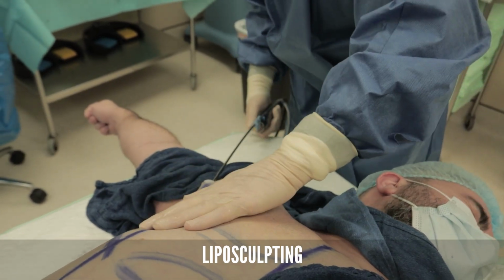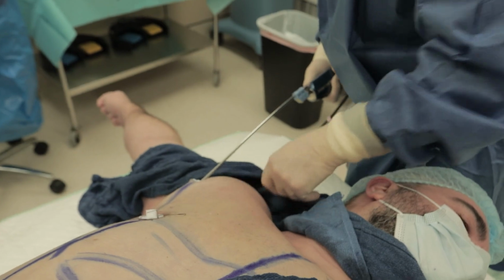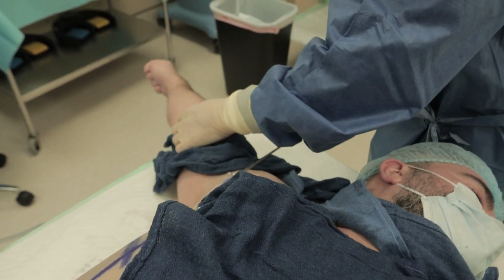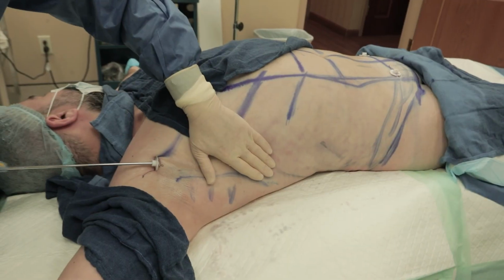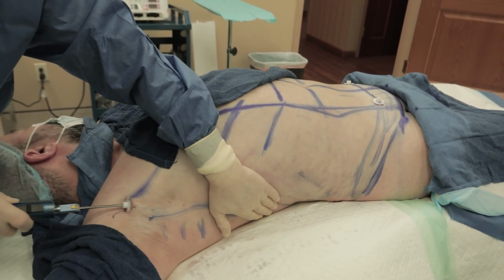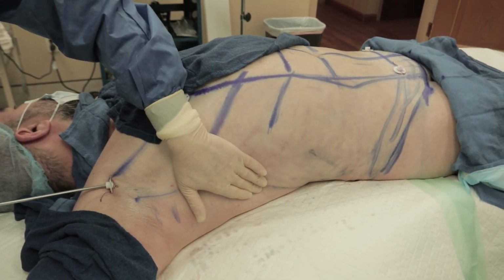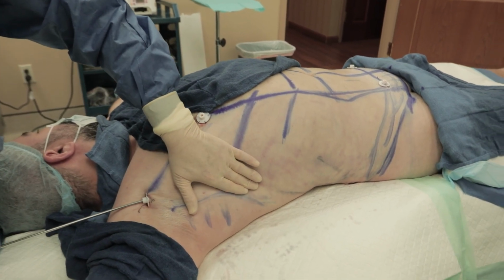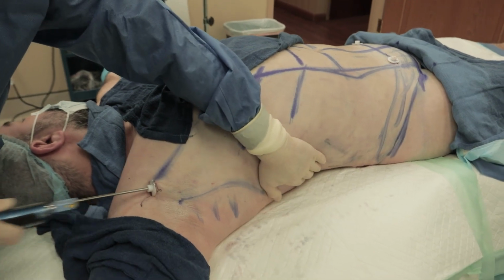And what we're doing now is lipoing. We wash them down, remark them, long cannula, and we're etching. Remember, he had gland removal in Philly a couple years ago. No real lipo, he doesn't think. He doesn't know because he was asleep, and the doctor didn't tell him.